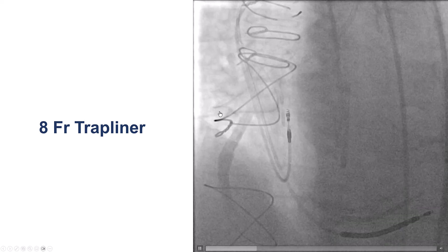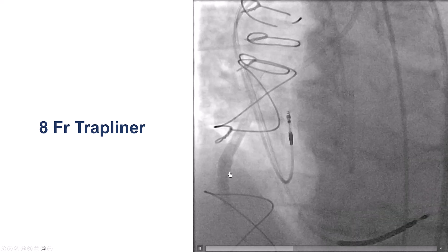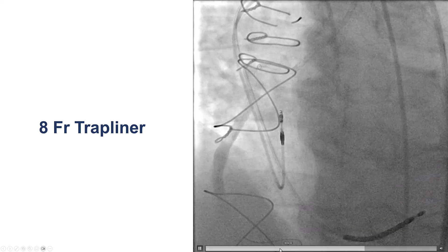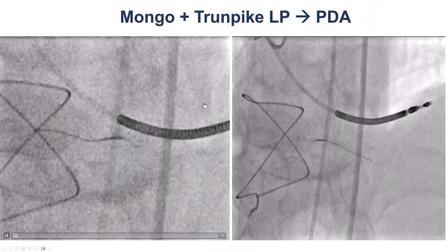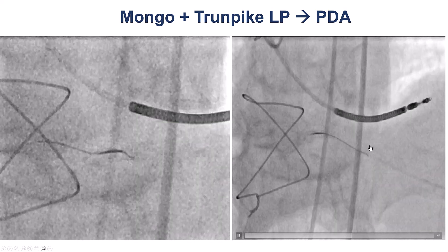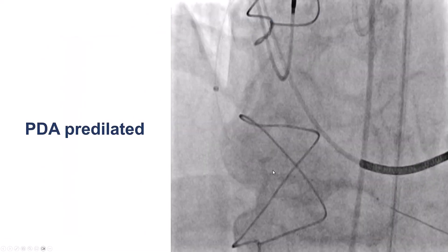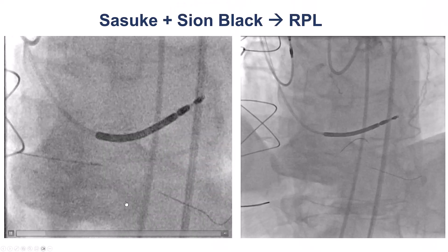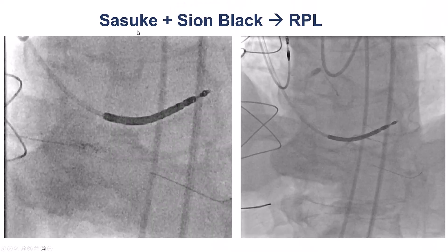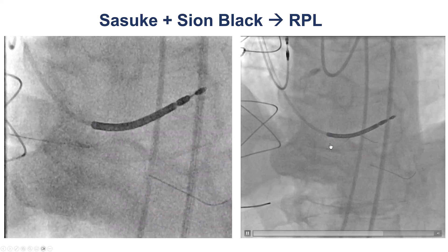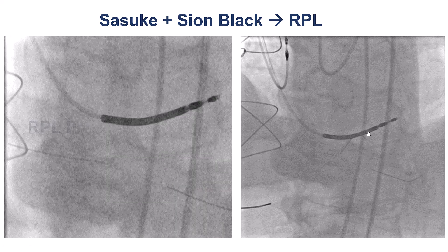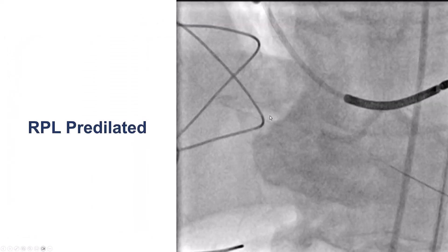We inserted an 8 French guide extension into the saphenous vein graft and advanced a guide wire, which went easily into the PDA. After doing that, we were able to predilate into the PDA, which restored some antegrade flow. We then used a dual-lumen microcatheter, a Sasuke, and advanced a Sion black wire into the right posterolateral.